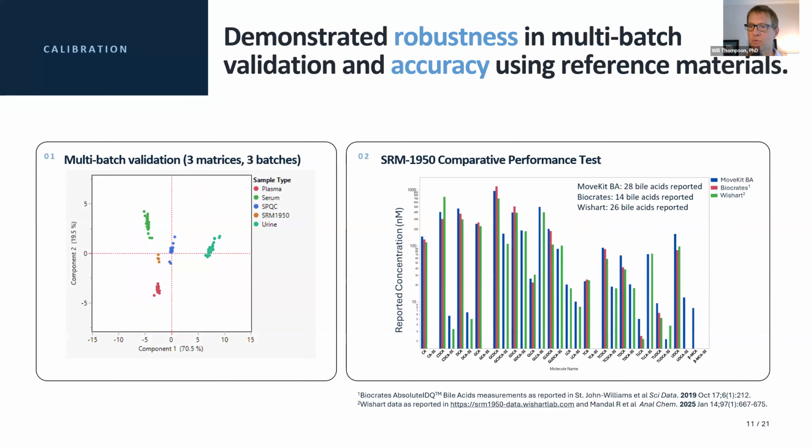We feel like with this approach, in this experiment, we're getting nominally the same values as other labs. And we expand the coverage because of the expanded target list. We expand the coverage beyond what is otherwise commercially available.